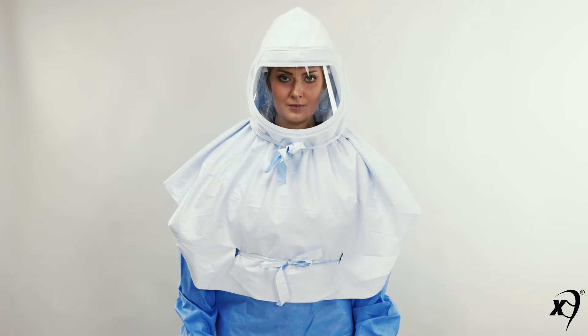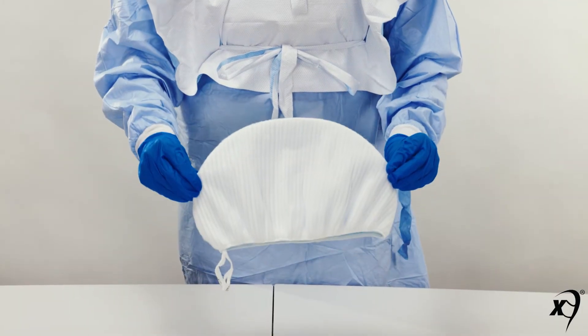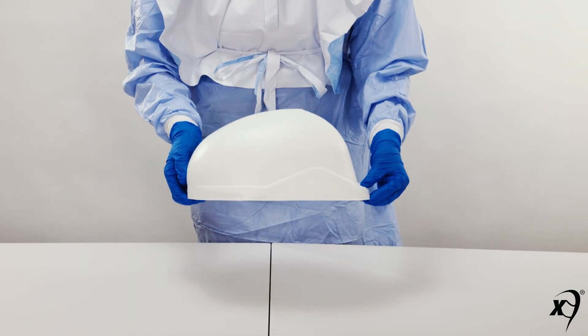For those wearing an 07 hood for heavy loading environments, don a heavy loading filter. Then don a high-fluid resistance filter cover cap.